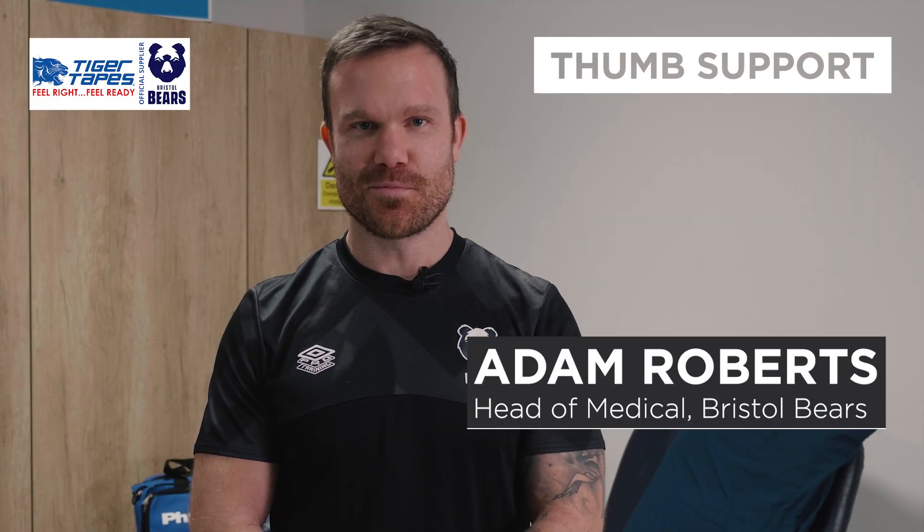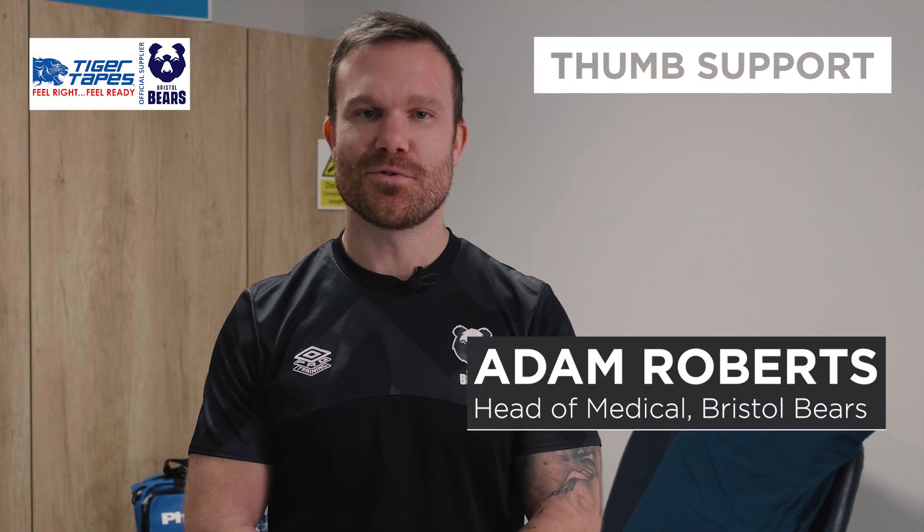Hi, I'm Adam Roberts, Head of Medical here at Bristol Bears. Today I'm going to be taking you through some common taping techniques that we use, using Tiger Tapes that you can purchase from Physique.